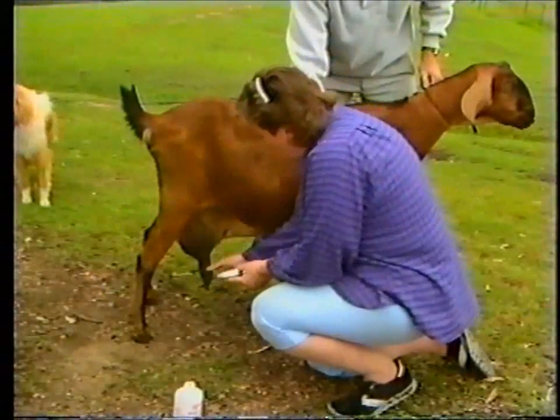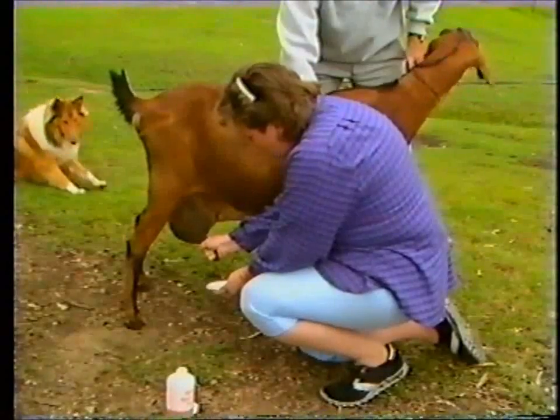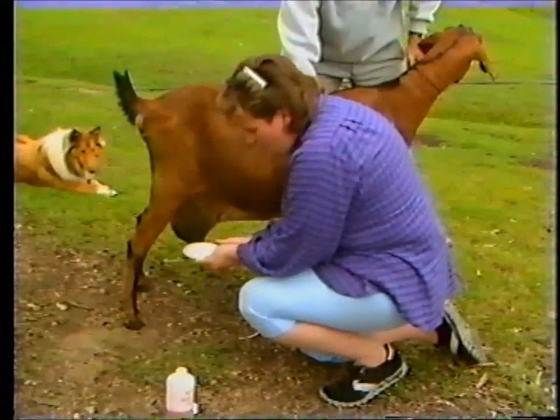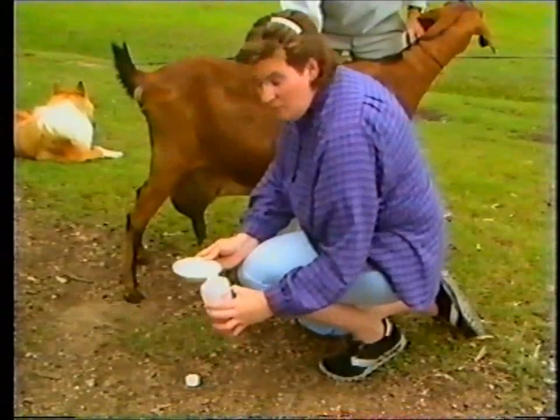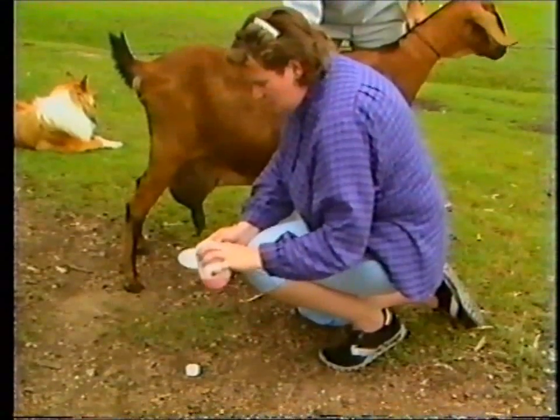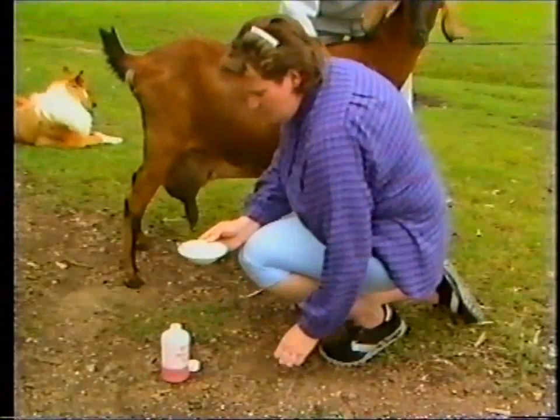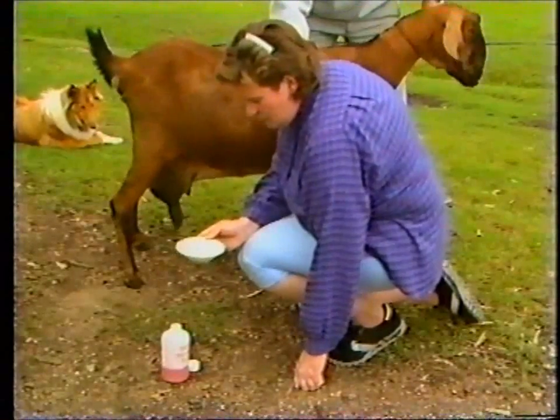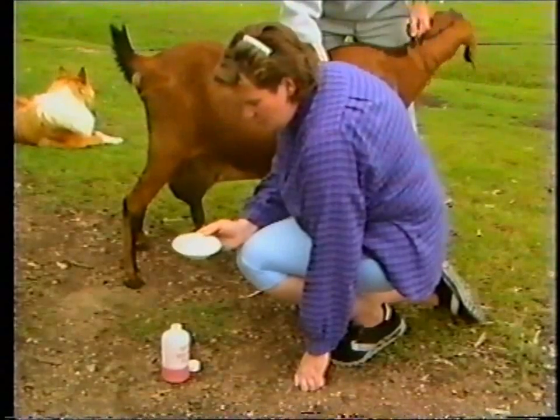I'm now going to perform a rapid mastitis test. I take a volume of milk into a clean white container, then add an equal volume of the rapid mastitis test reagent. This mixture is then swirled slowly and gradually for 30 to 60 seconds.